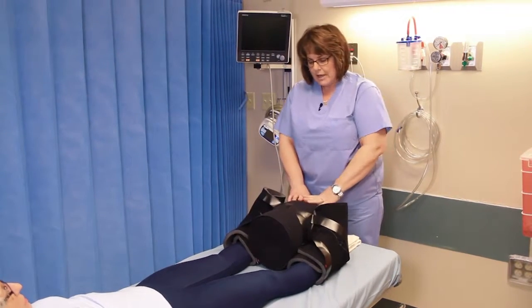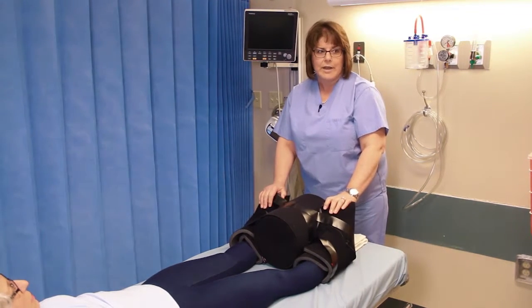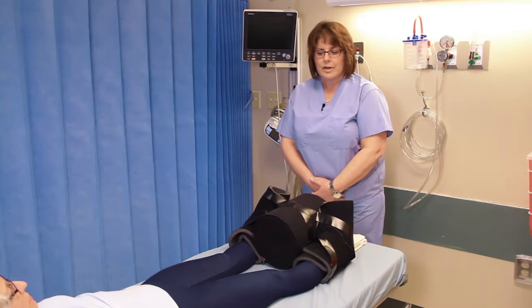You'll be wearing either the boots or the hip brace for the next two weeks. And that's how you put on the anti-rotational boots.